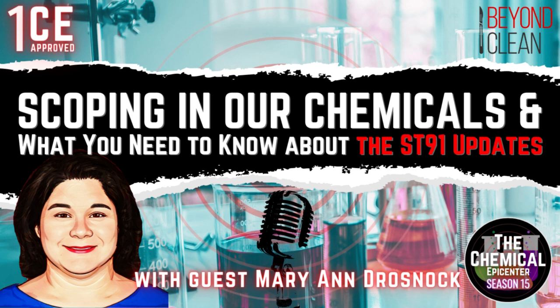Yeah, Justin, that's a great question. And I don't even know where to start because there's so much I could say on this. So yes, for sure. Let's start with the obvious, right? The elephant in the room. Sterilization. There is definitely a trend, and one that I am a proponent of, and I hope goes really to the next level, which is sterilization of endoscopes. So I think in our heart of hearts, we all want scopes to be sterile. I don't think that patients know that the scope used on them isn't sterilized.